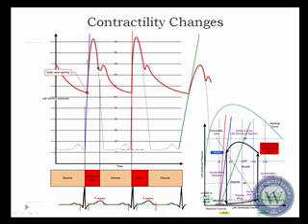Contractility changes can be seen here by looking at the velocity of this slope increase. This is a part of the isovolumetric line. What I've done for you is show where contractility is actually taking place. It's based on this blue line here. That's considered normal in this case, and this would be a situation where your increase in contractility, as you can see, becomes more vertical. And then you can see a person has a decrease in contractility. You can see the actual A line begins to develop this lazy S, and you can see that the stroke volume drops off. That's why the pressure sort of falls.